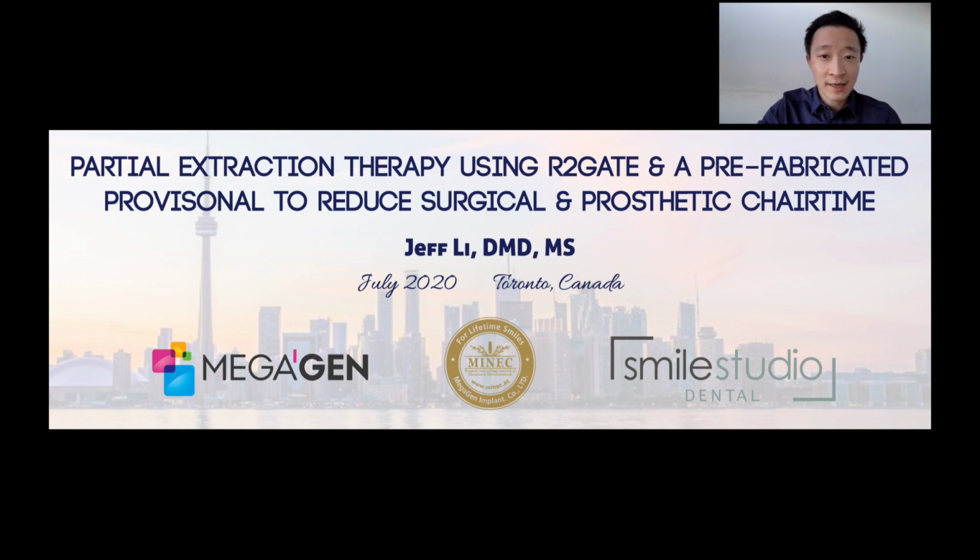Today I'm presenting a case discussion with the theme of minimizing chair time, which I think is very important given the current pandemic situation. My title for today is Partial Extraction Therapy using R2Gate and a Prefabricated Provisional to reduce surgical and prosthetic chair time.